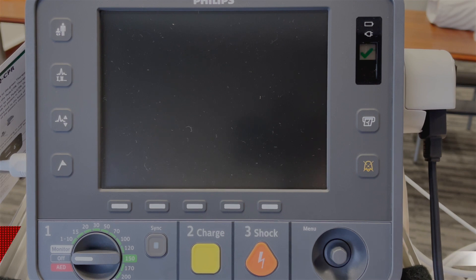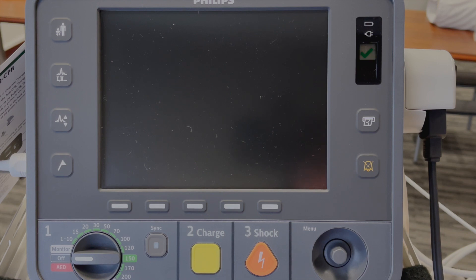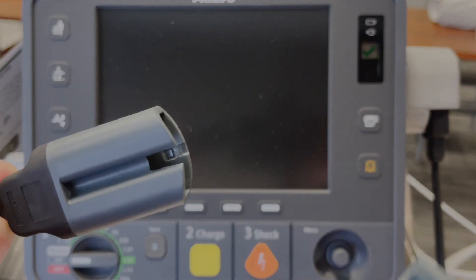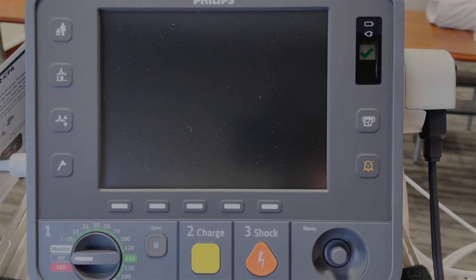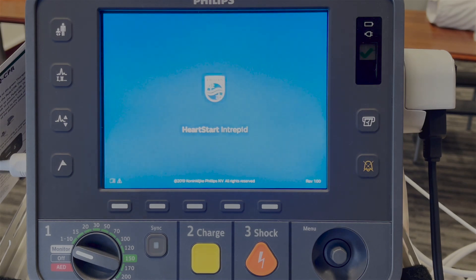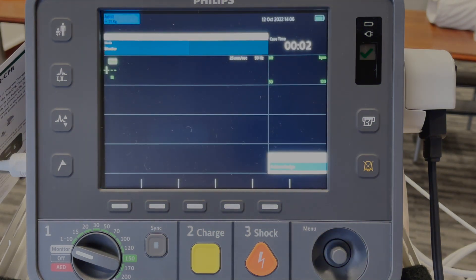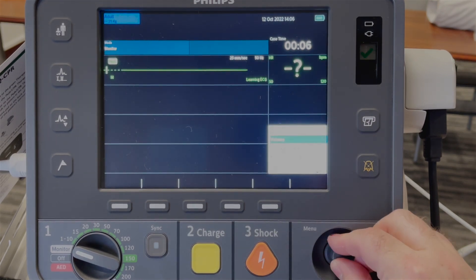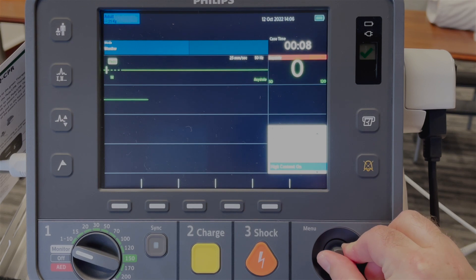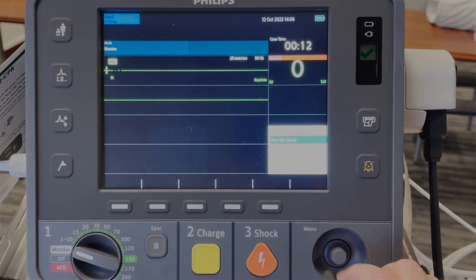Let's review how to perform an operational check. Make sure you connect your therapy cable to your test load. Switch the device on into monitor mode and wait for the device to boot up. Press on your menu button, scroll down until 'Other' and select 'Operational Check'.